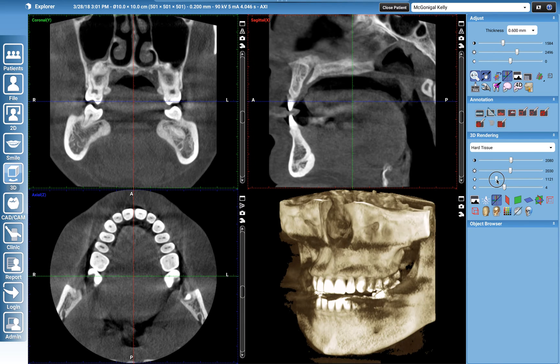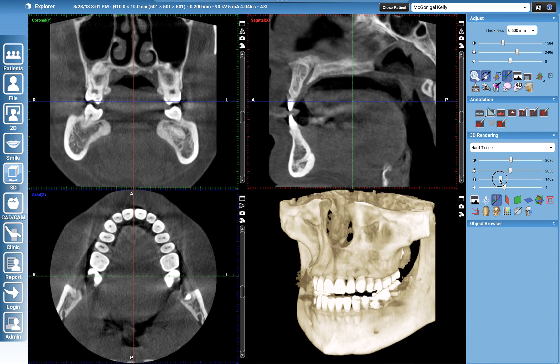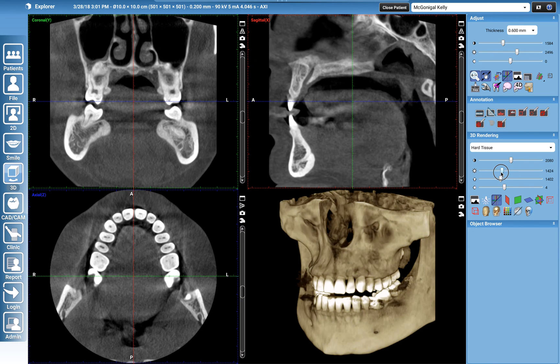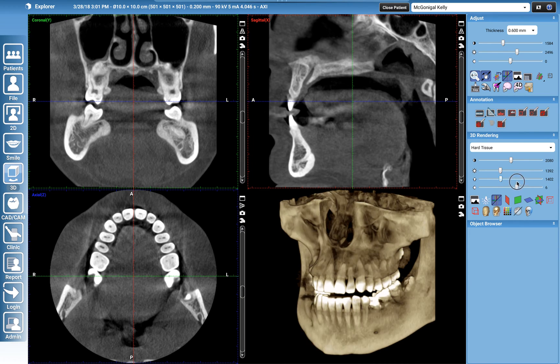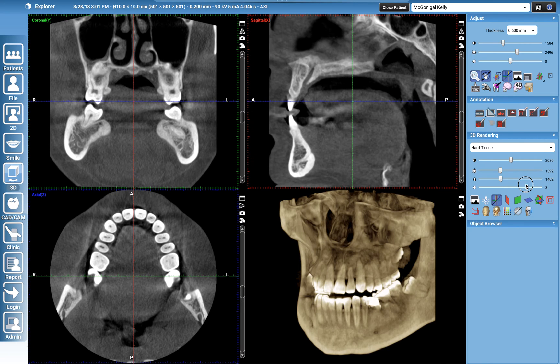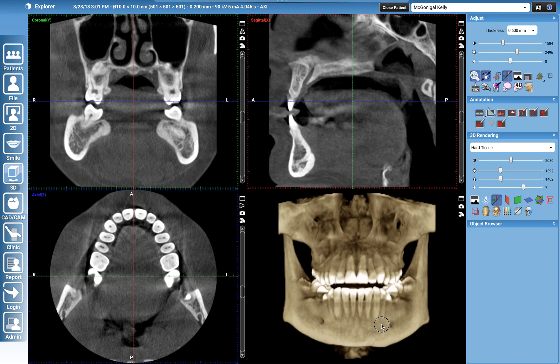I can increase this little up arrow and you can play around with it just to see what you like. This bottom arrow allows the bone to be a little bit more translucent so you can actually see where root tips are.